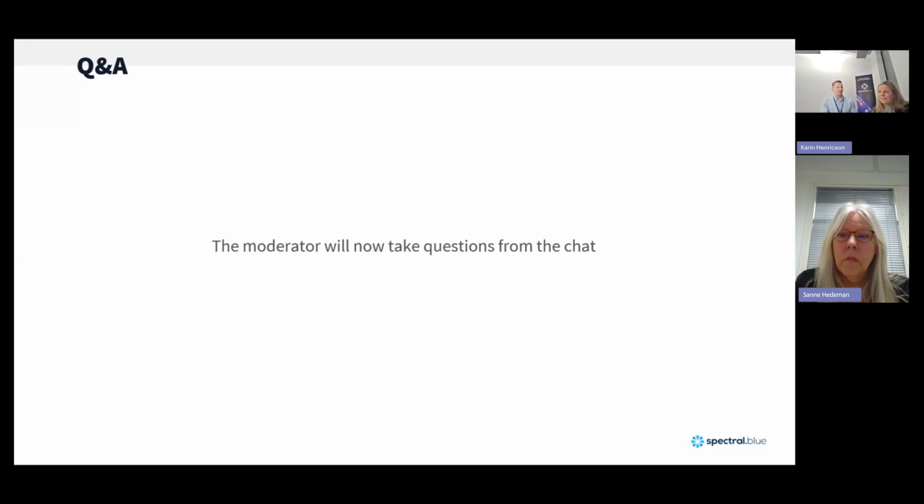Well, I think Karin here is more of an expert in this topic. So that's of course if you want to show it with microbial tests. But of course, because these are LEDs, you will also see if the blue light is not working. If one LED dies, you will see it with your bare eye. And also we can measure the intensity of the light.